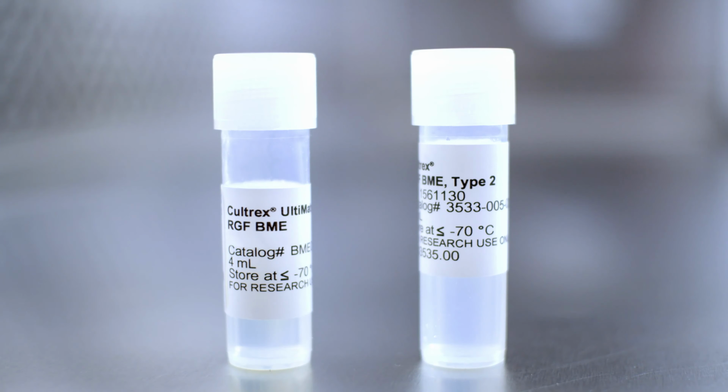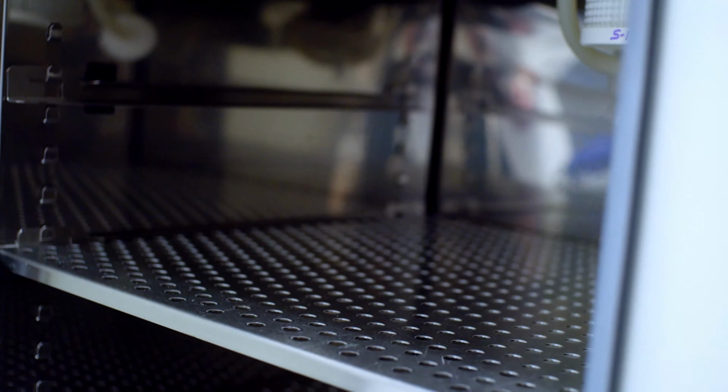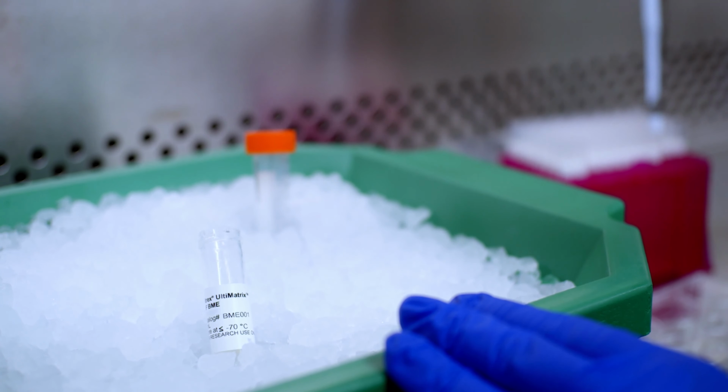Cultrex Ultimatrix BME and organoid qualified Cultrex Reduced Growth Factor BME Type 2 are used to generate domes for organoid culture. Prepare your cell culture vessel by pre-incubating it in a 37 degrees Celsius incubator. The pre-warmed plate promotes proper dome formation when plating.